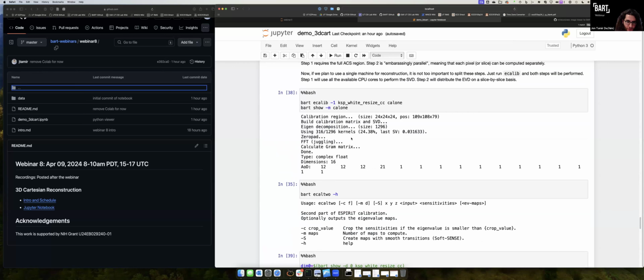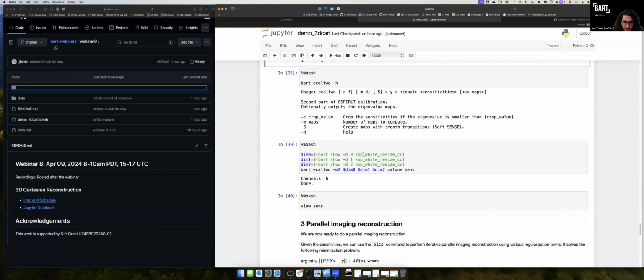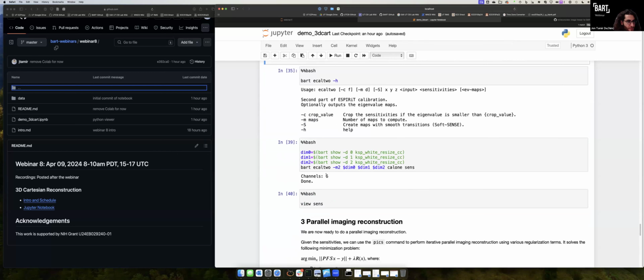And of course, if it's too large, then you're sort of oversampling your data, and maybe it's better to get higher frequency samples than lower frequency. So I think it's application dependent. I would say typically, if you're doing something that's not too phase sensitive, then being 32 or smaller, like between 32 and 18, is a good rule of thumb for 3D Cartesian. So those are good questions.